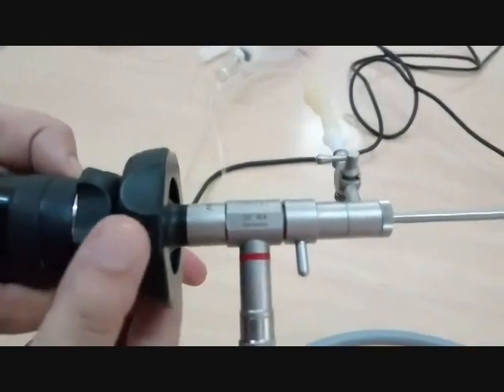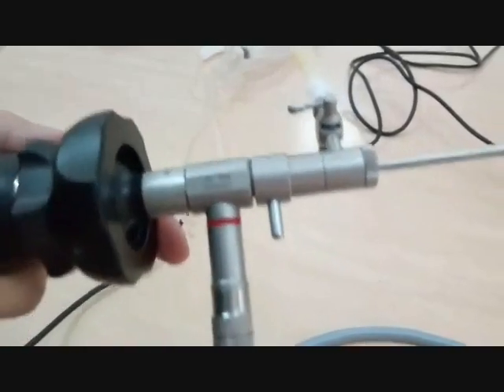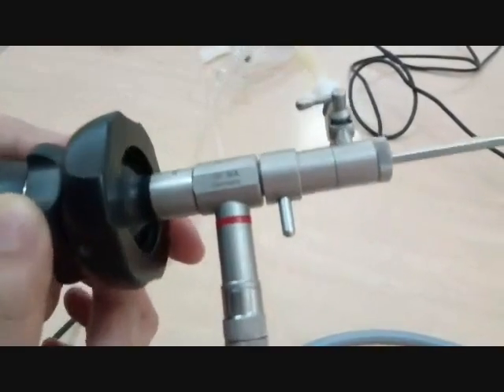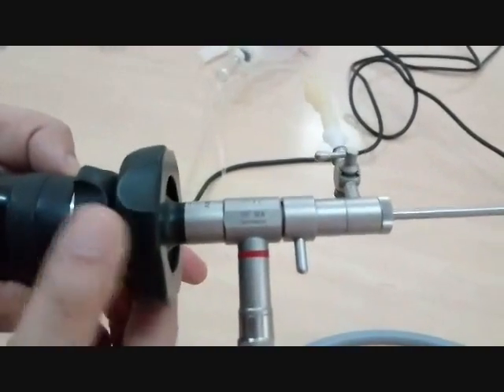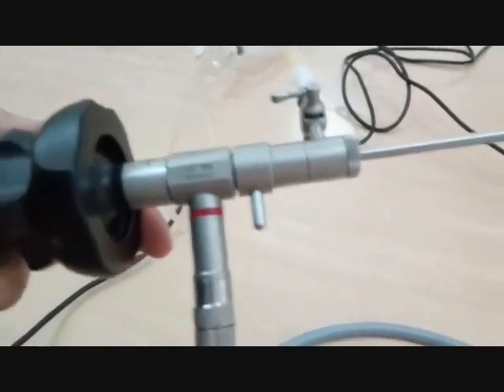Thanks to this small ring, we saw that the first big ring was for the camera, for the scope. The small one here is for adjusting the focus, like that. Just make sure that the rest of the camera doesn't move, just the small ring, like that. We move it and we adjust the picture.